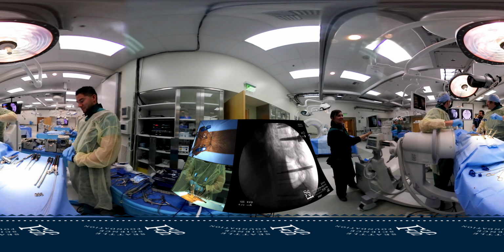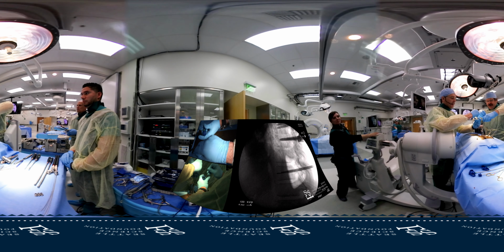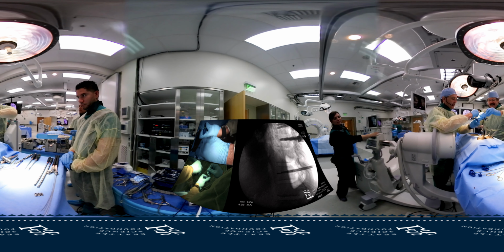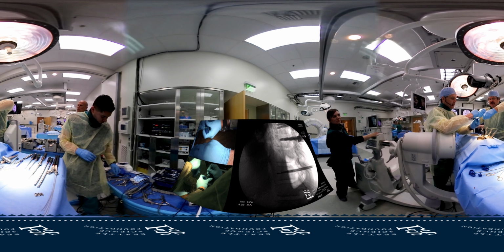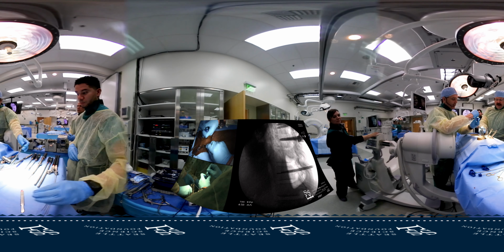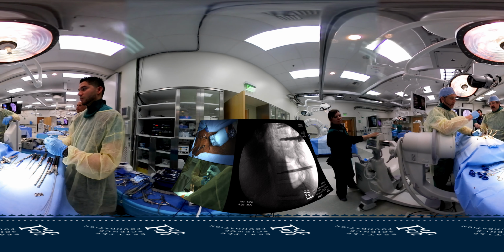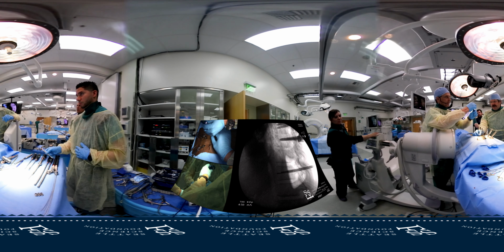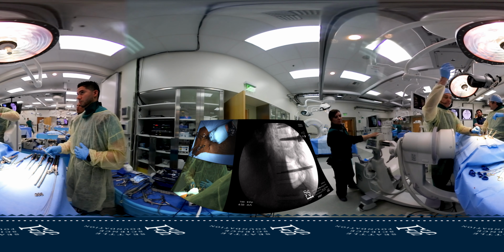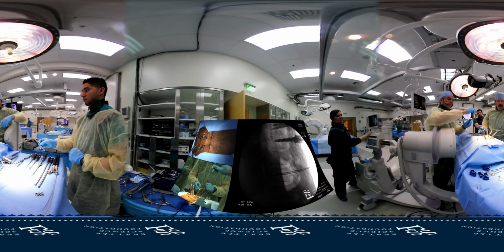Picture. All right, you can see both my wires are in, and I'll back the jamshidis out now. Again, it's a little tough with these long ones, but we'll wiggle them loose and back it out, maintain that position. This is one of the places where you can run into problems because you can lose your wire. Okay, picture. You can see both our wires in place.